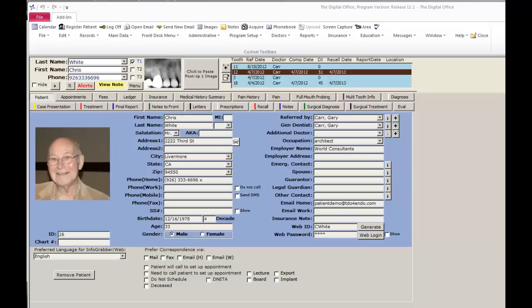This tutorial will give a broad overview of the steps of working up a patient in the operatory. Each of the forms we're looking at in this tutorial will be covered in much greater detail in other tutorials in this series.